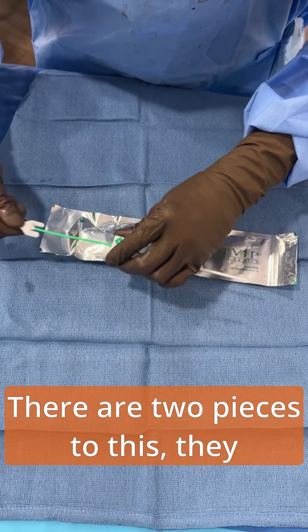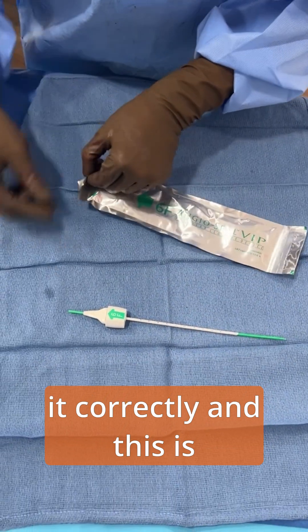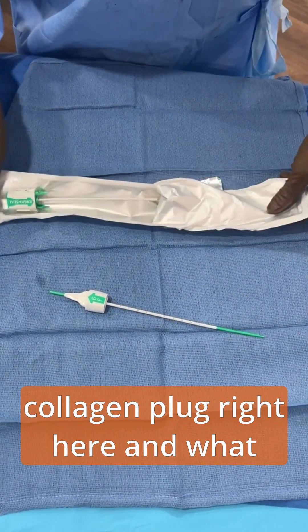There are two pieces to this — they click together. There are little arrows telling you how to assemble it correctly, and this is just the insertion sheath. The angioseal is this little collagen plug right here.